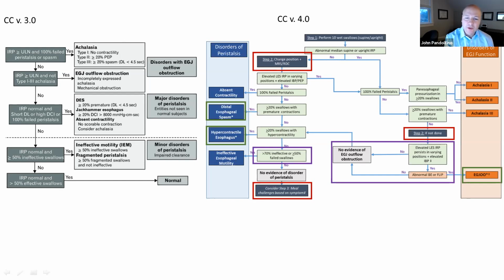Yeah, so it would be almost impossible to put all of this work into one manuscript. So as we plan this out, we would provide the first paper, which would be an overall description of the Chicago classification, but then we're allowing each working group to present each month their work, focusing on the protocol, this new EGJ metric section, and we'll go through each one of these diagnostic classifications in much more detail in subsequent versions and articles in NGM. And I think it really gives each working group an opportunity to also discuss the controversies that they addressed.